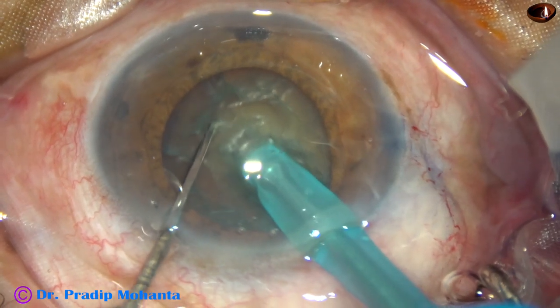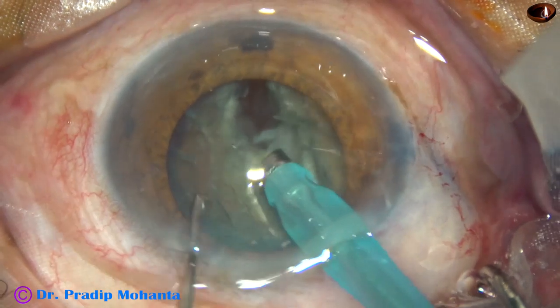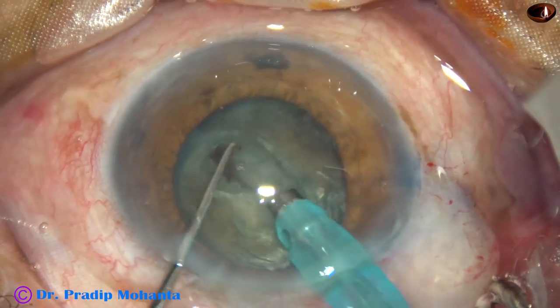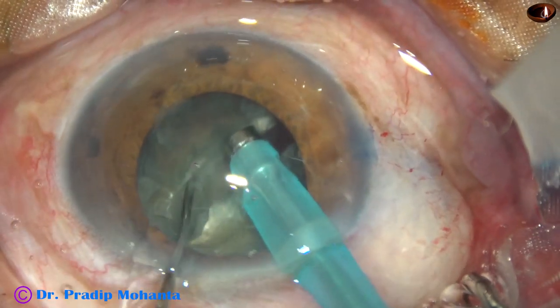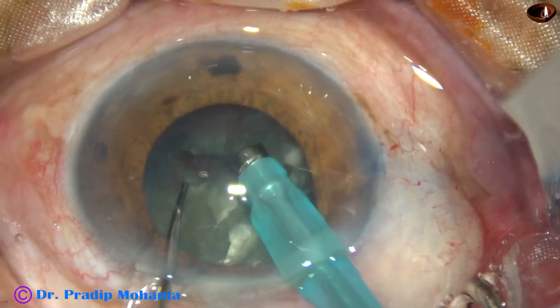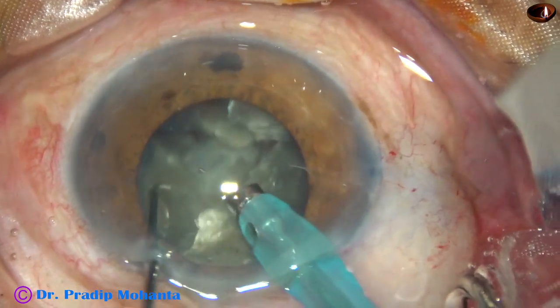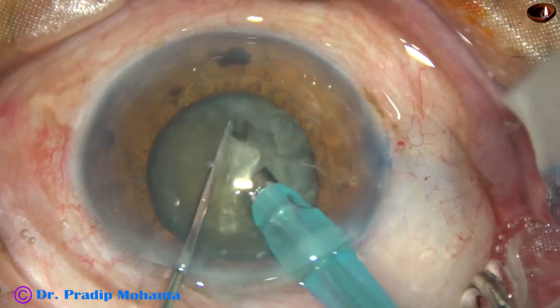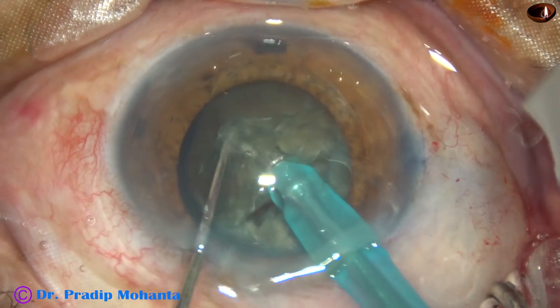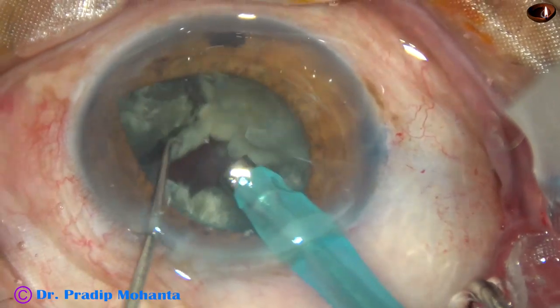The exposed part of the phaco needle is buried in the substance of the nucleus. It travels through the nucleus for some distance, goes near the opposite equator, and then the chopper is used to divide the nucleus into two halves. The nucleus is rotated 180 degrees, and the two hemi-nuclei are separated completely. Then each hemi-nucleus is divided into two fragments, so the nucleus gets divided into four fragments.